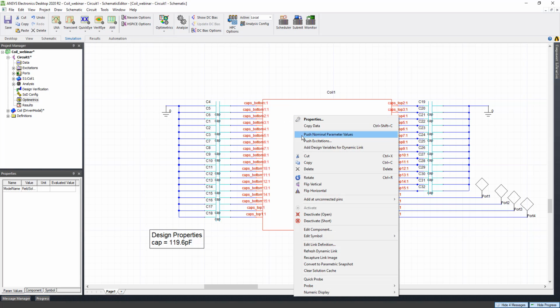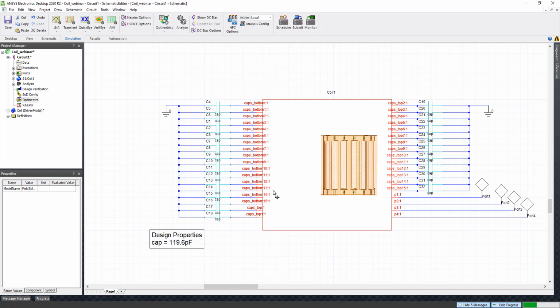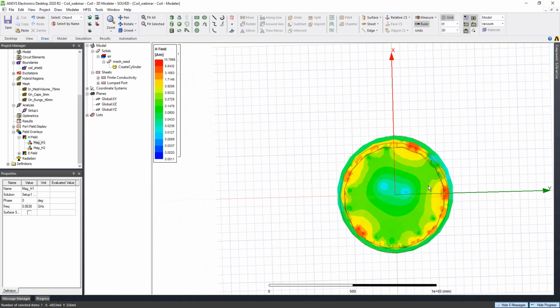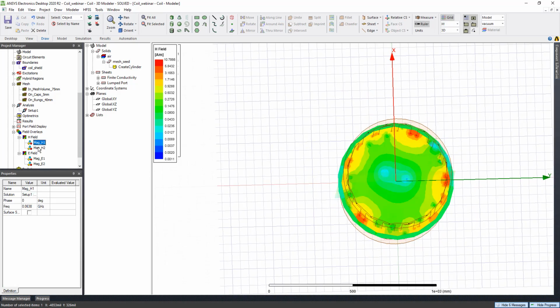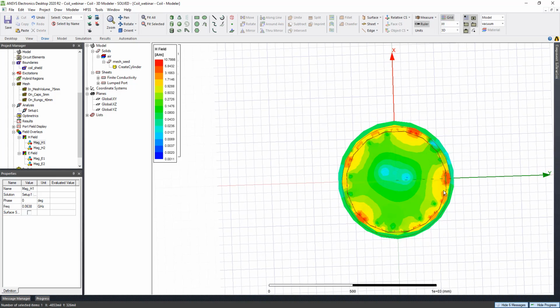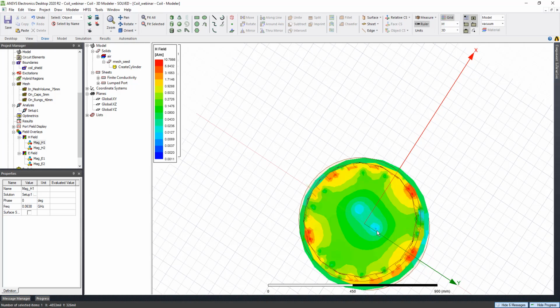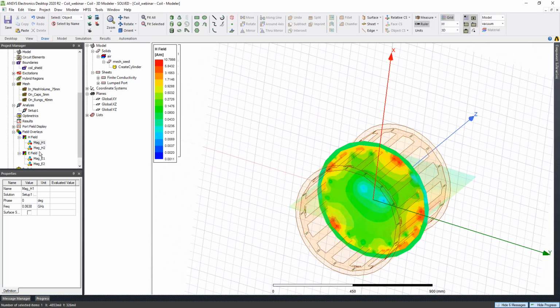Yeah, after the simulation is done, we want to push the result back to our 3D design, so we can right click on the model and then push excitation. It's okay. And now we can go back there. Oh, I forgot to save the field from earlier, but now you can see that the field is a little bit more uniform than what we had before, for the magnetic field. But you are always welcome to fine tune it. Right now it's somewhat uniform, but not quite. So this is what we have.